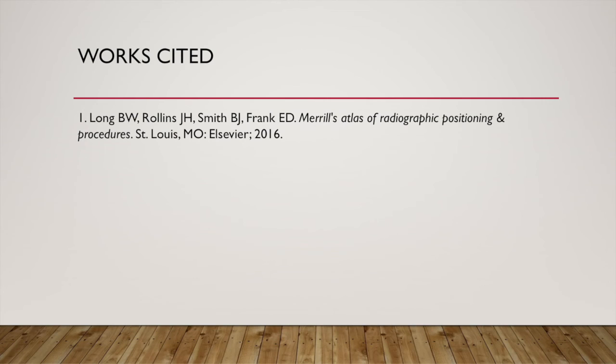There are other non-routine lumbar spine exams such as hyperflexion and hyperextension, which can be done lateral or AP, PA projection or weight-bearing method for evaluating intervertebral disc spaces, and there's also the thoracolumbar spine to observe scoliosis. But I won't get into too much detail into these exams because the focus is on the standard protocols at most facilities.